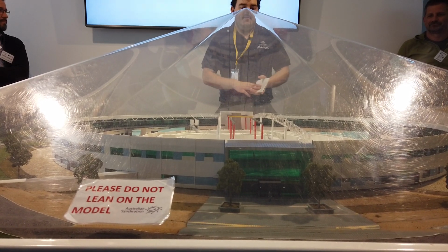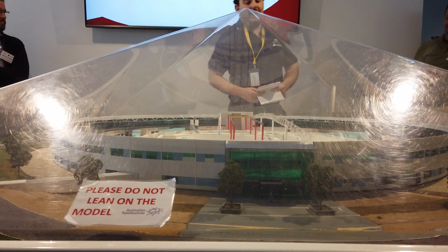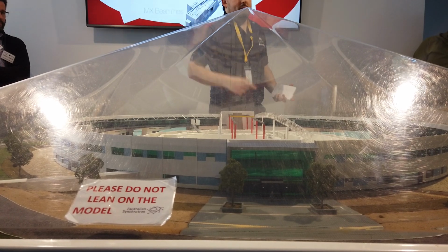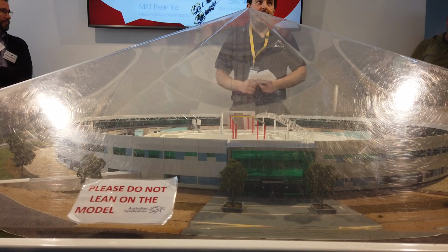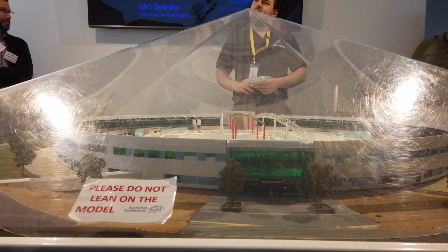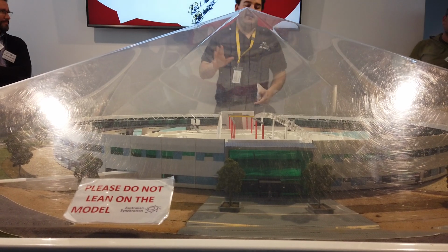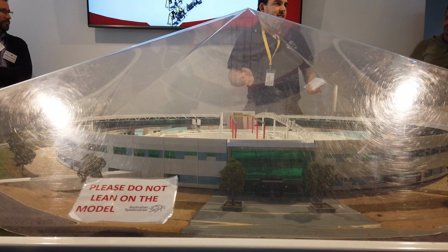So as we accelerate them, we use a combination of radio waves. So we have a radio wave resonator inbuilt to our linear accelerator and our rings here. So there is a radio wave and it oscillates at a frequency of 3,000 megahertz. And we use that to essentially accelerate our electrons. They ride the waves like a surfer rides the wave at a beach.